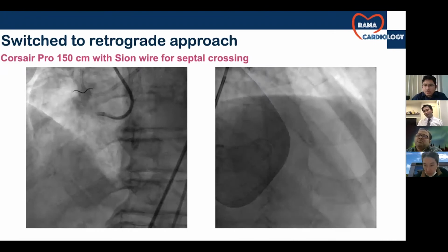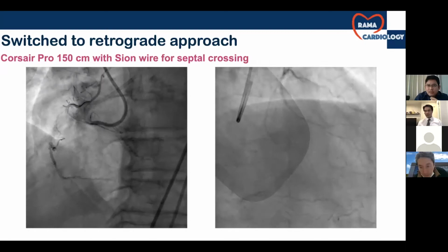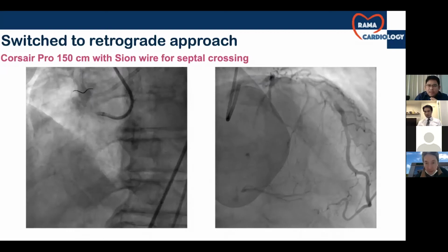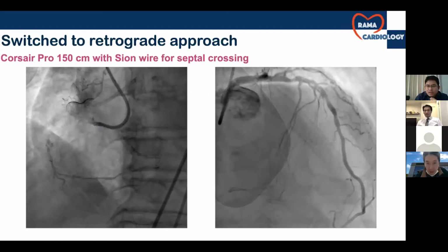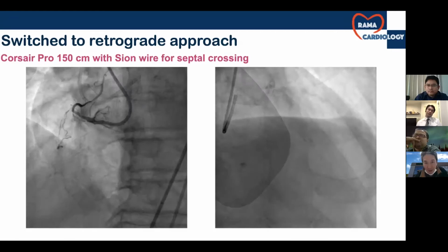And I want to ask Dr. Nakamura. In the case with the septal collateral channel, the bigger one is the promising one and the only one that supplies the CTO, and the other one is just tiny. If we use the big one, we cut the supply for the CTO. Would you prefer the smaller one and do the septal surfing like that, or do you still prefer the large one? Yeah, I prefer the large one. So I think it is easier to cross, and we want to shorten the procedure time.